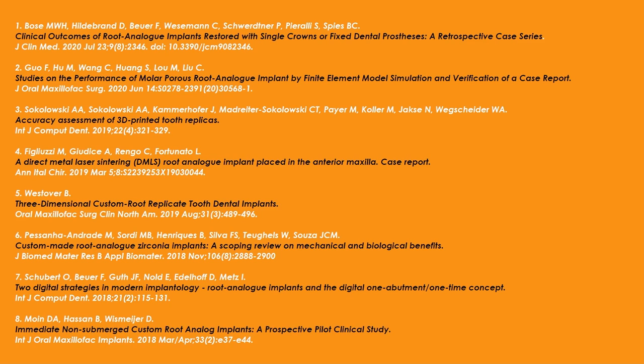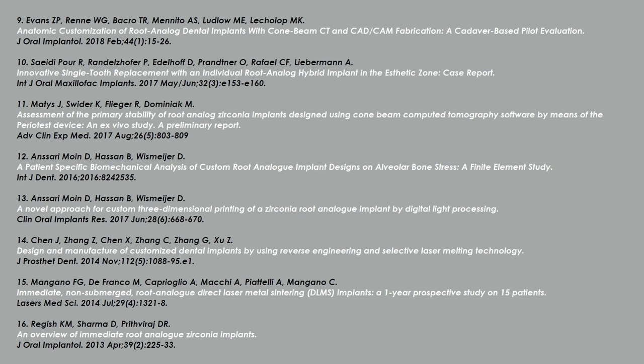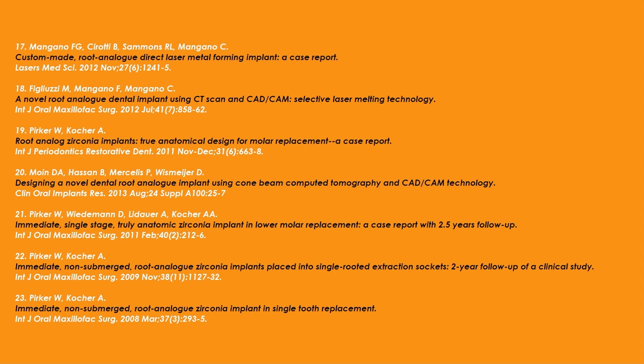And here in these slides we find the most recent publications, some of which are from our group. We published them together with Professor Figliuzzi from the University of Catanzaro, and with different specialists like Dr. Cirotti, on different cases, I have to say. In total we performed only 15 cases, but all these cases were on patients, so in vivo studies, with root analogs in titanium or titanium alloy, so 3D printed root analogs.